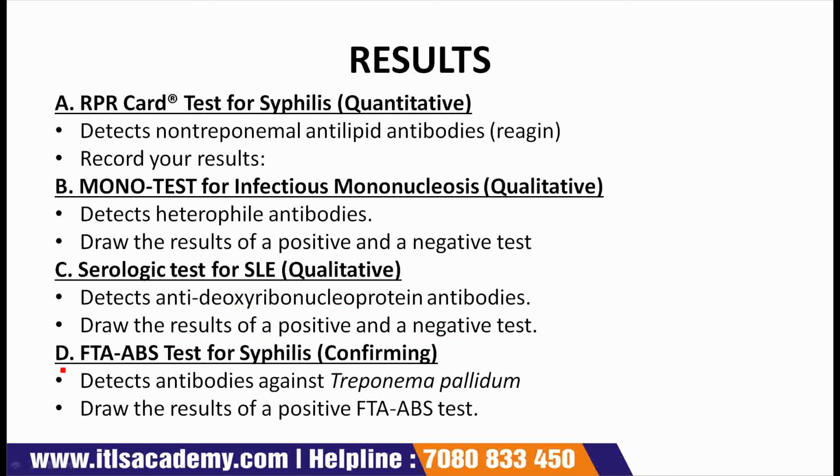Next is the FTA-ABS test for syphilis, and this is a confirming test. This detects antibodies against Treponema pallidum. For its results, draw the results of a positive FTA-ABS test.